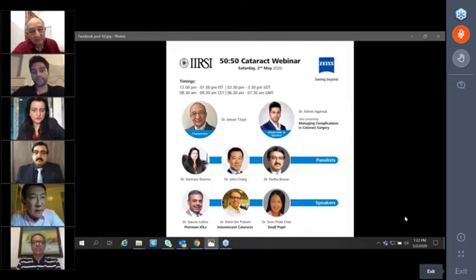For the elderly, I agree very much with Dr. Titiyal, but the more elderly, maybe 80 or above, most of them have very small pupils. So they already have very good depth of focus. So they may not actually need a multifocal IOL or something. I may just put an EDOF or something, maybe a monofocal.